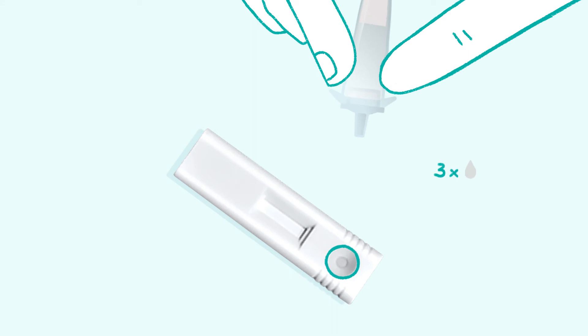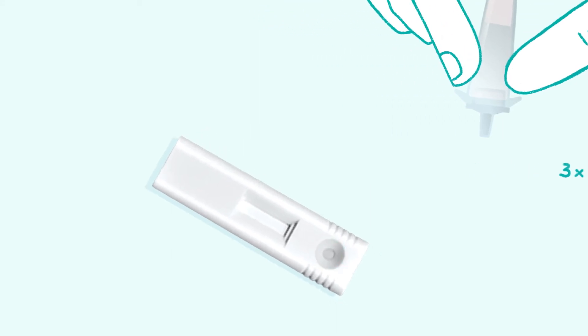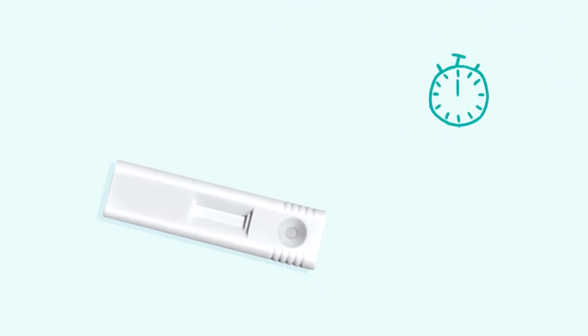Add three drops to the sample well on the test cartridge. It is okay if the first drop contains bubbles. This will not affect the test results.